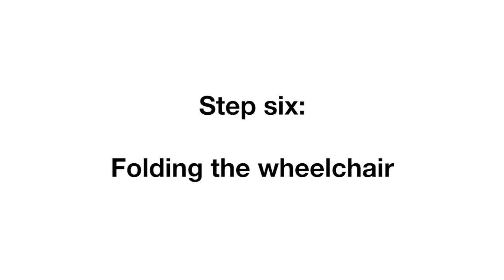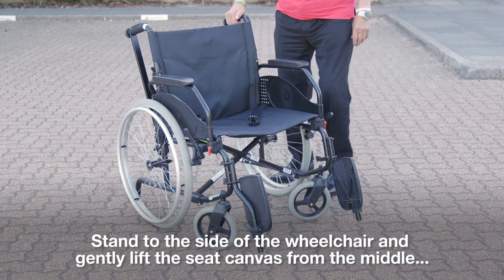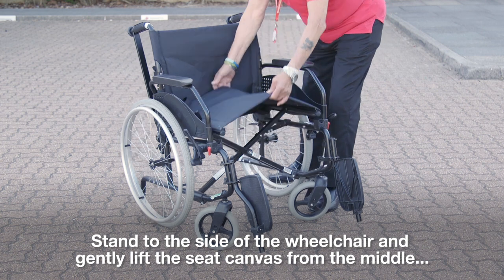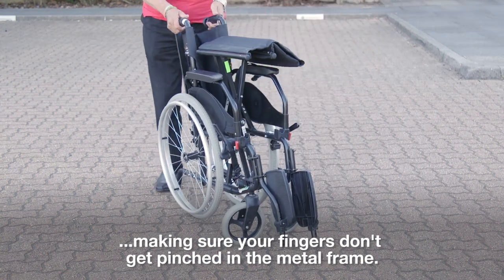Step 6, folding the wheelchair. Make sure the footplates are folded up. Stand to the side of the wheelchair and gently lift the seat canvas from the middle, making sure your fingers don't get pinched in the metal frame.